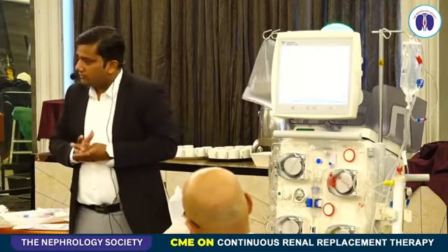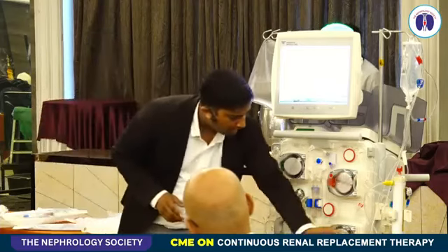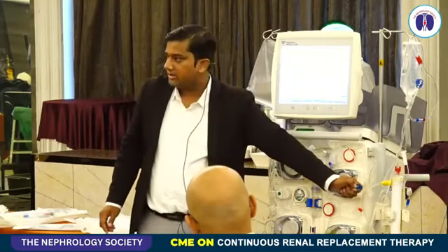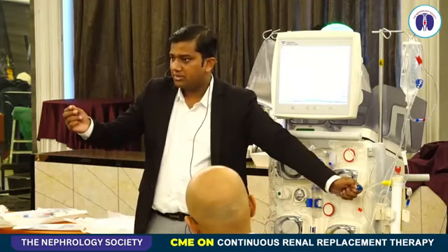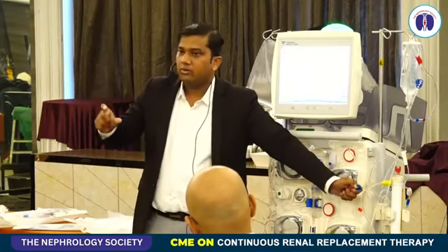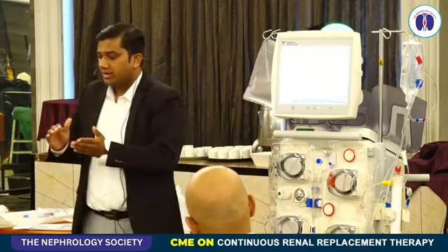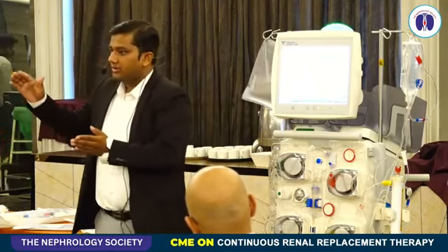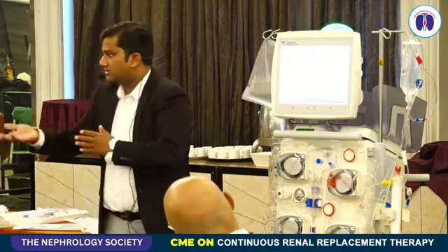And it is as per the post-ionized calcium. From there we can take a sample of the after-dialyzer blood sample to see how much calcium, and accordingly we can take a call how much calcium we want to give. Let's say it is increasing or decreasing by 0.5 milliequivalent, we will increase the dose of calcium, and vice versa also can be done.